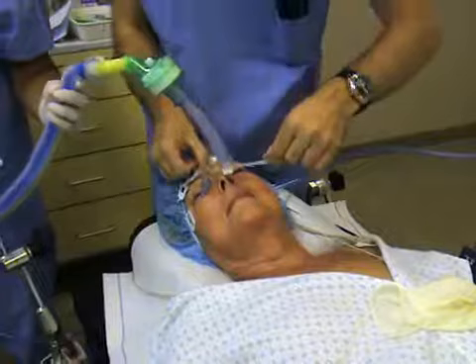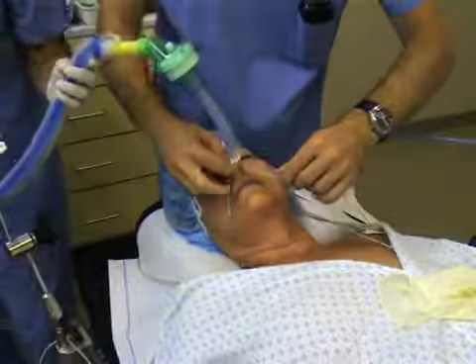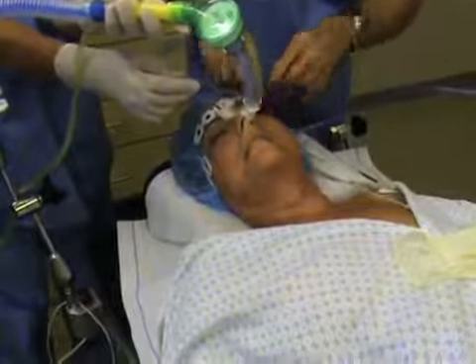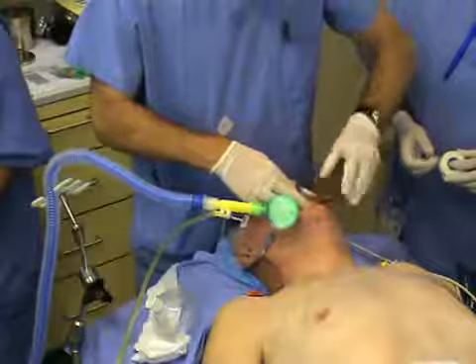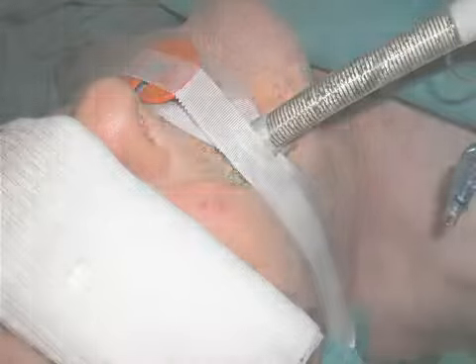Using adhesive tape, fix the tube onto the bridge of the nose or, in oral intubation, onto the maxilla. Then fix the tape with an additional ribbon to keep the tube from being displaced. Stabilize an oral flexible tube with the previously used oral airway.